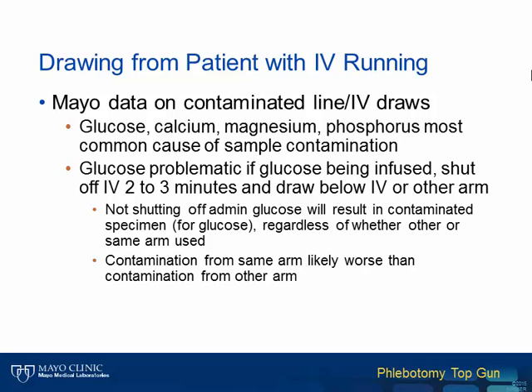Within our practice at Mayo, we have an IT system used in our central and stat clinical laboratories that allows us to detect patterns of results that likely represent contamination with IV fluid. In these cases, we most often initiate a redraw for these specimens. If the results obtained with a redraw specimen are different from the original results, we confirm that the specimen contamination did in fact occur on the first draw.